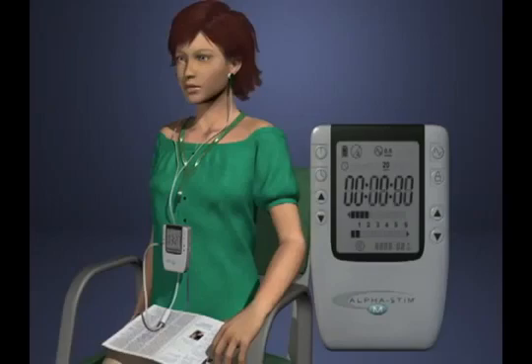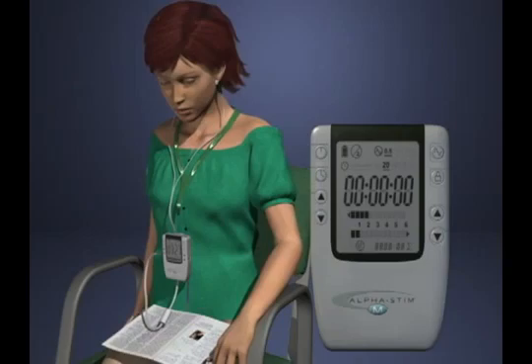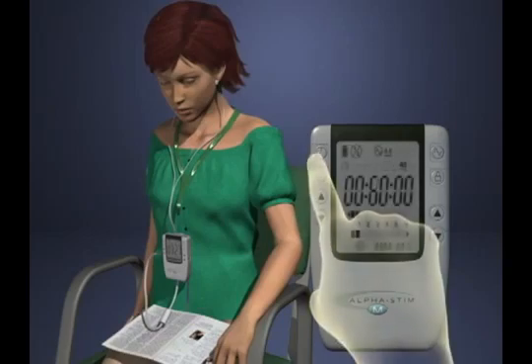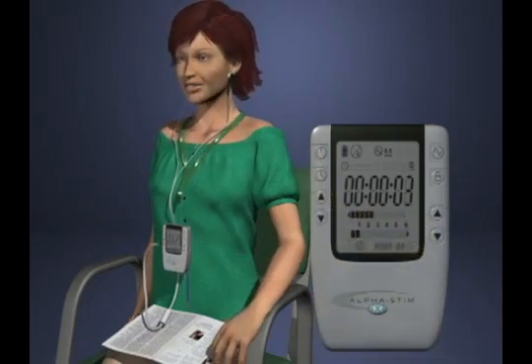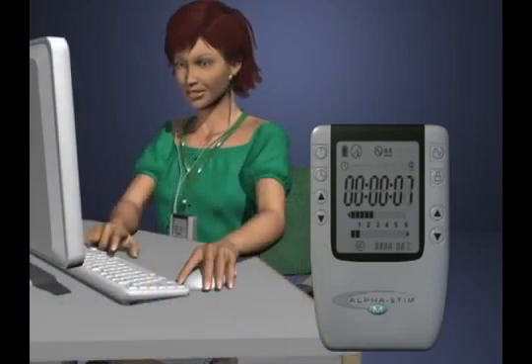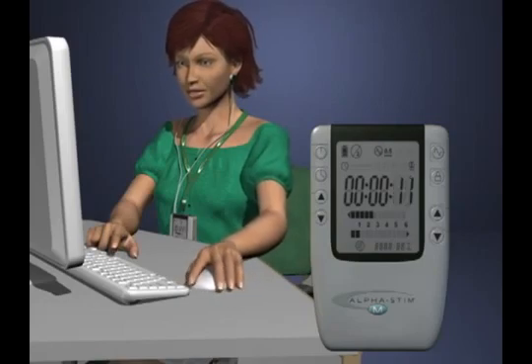When the timed session ends, if a heavy feeling is still experienced, resume treatment until at least 2 minutes after the heaviness lifts and a light feeling develops. Cranial electrotherapy stimulation may be used as often as necessary, but for most people it is best to treat between once a day and twice a week. Results usually improve and last longer with additional treatments.